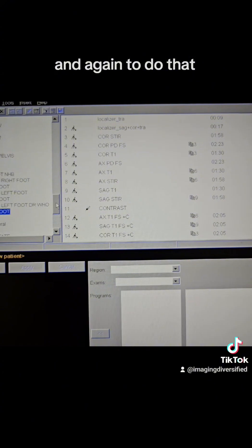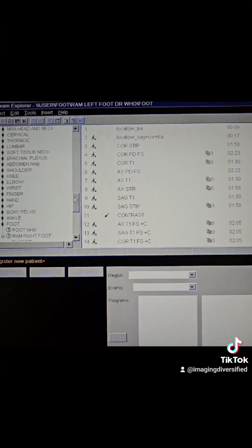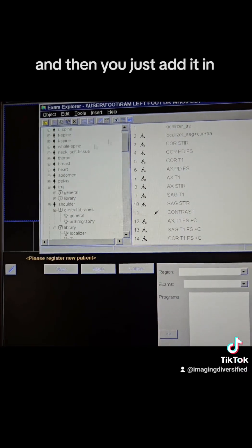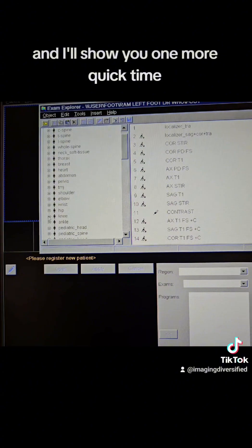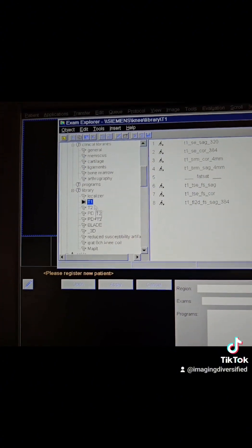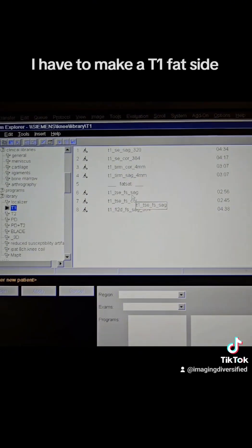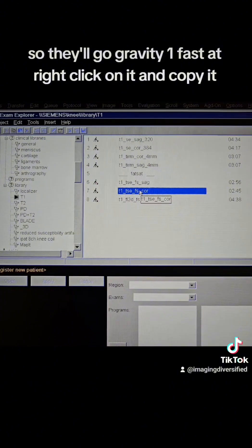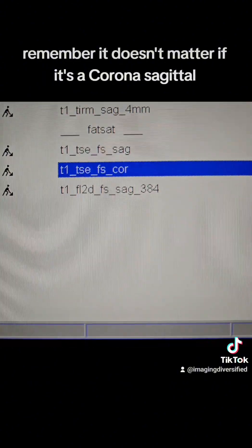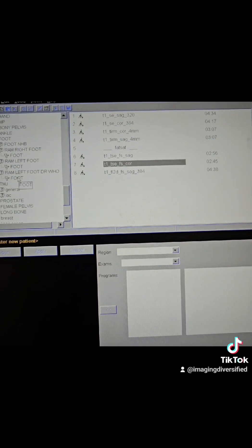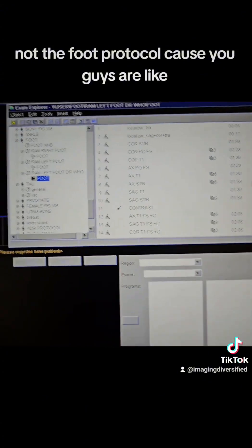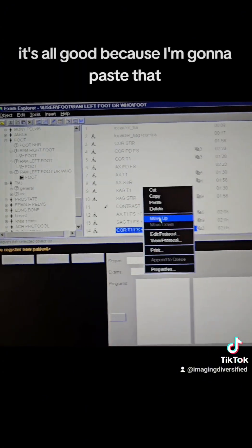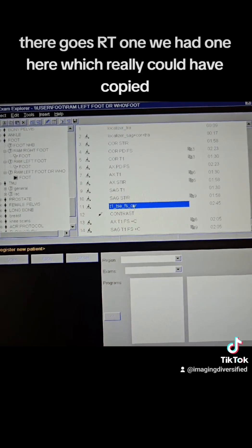Now you have two. This one automatically has your foot in it and now you can add in a specific sequence for Dr. Who. And again, to do that, you would just go to whatever sequence you need it. You would just go find it and then you just add it in. So if we needed to go get, let's say specifically a T1 and you said, you know something I have to make a T1 fat sat. Okay, cool. So we'll go grab a T1 fat sat. Right click on that. Right click on it and copy it. Remember, it doesn't matter if it's a coronal sagittal because we can always change the plane. And I grabbed it from the knee protocol, not the foot protocol.